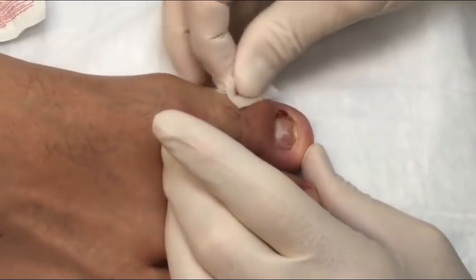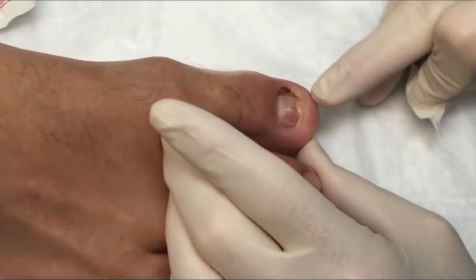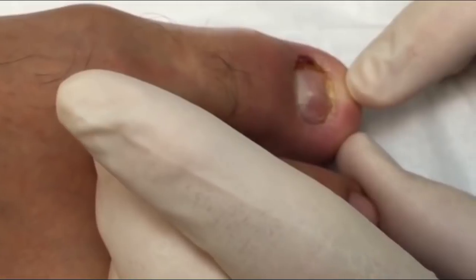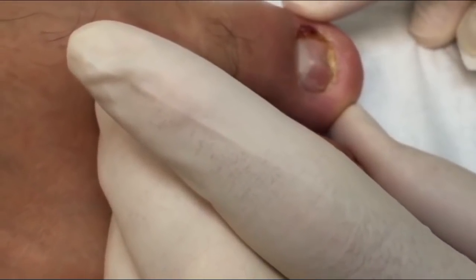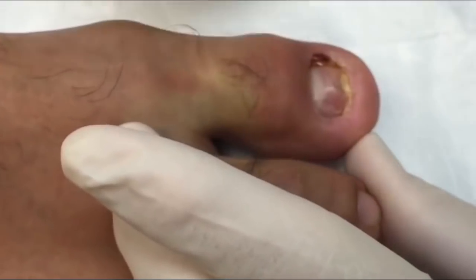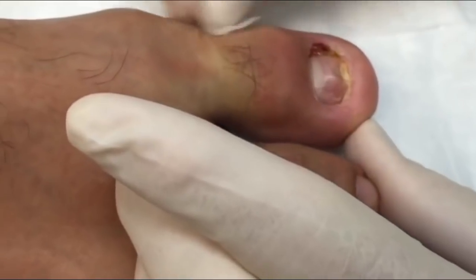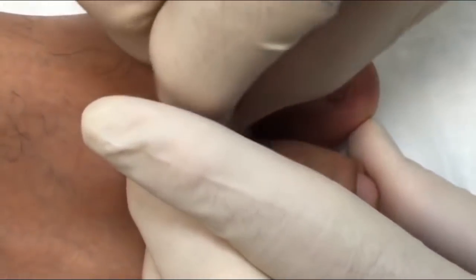Because for this gentleman, this is a very serious problem. He has an ingrown toenail, and you might be able to see by looking in here, he's had this removed already about 3 or 4 months ago, and it's growing back, and it's clearly ingrowing, and it's actually infected and pretty tender too. So what he's asking us to do is to take this ingrown portion of the nail out and to also go ahead and treat the nail matrix so that this doesn't happen again.